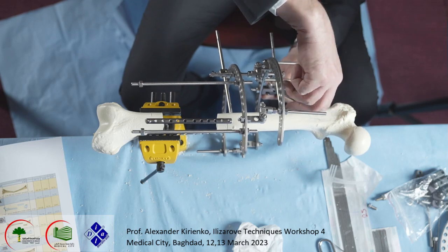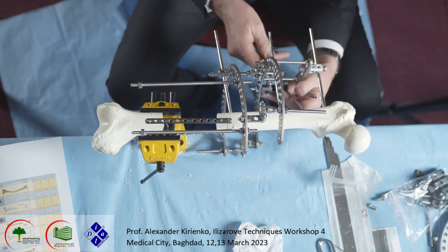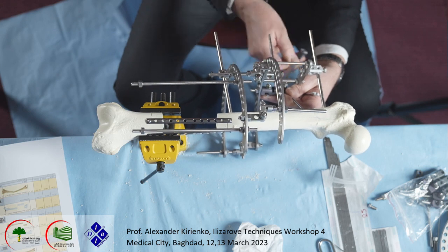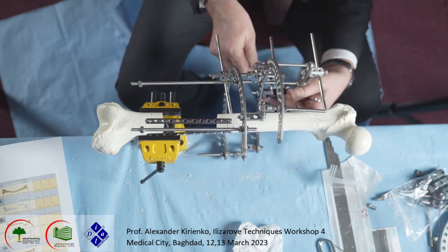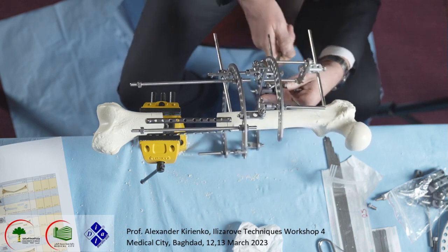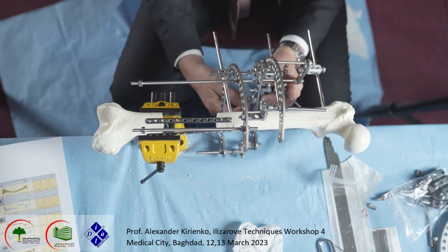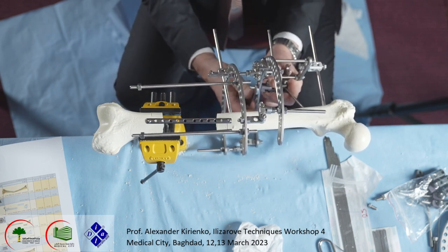Fix it in this way. Oops. Yeah, this system has a special nut that auto-blocks it. We fix it, it never moves. Okay, fix it here, and we fix it here. And now it's much more stable again.